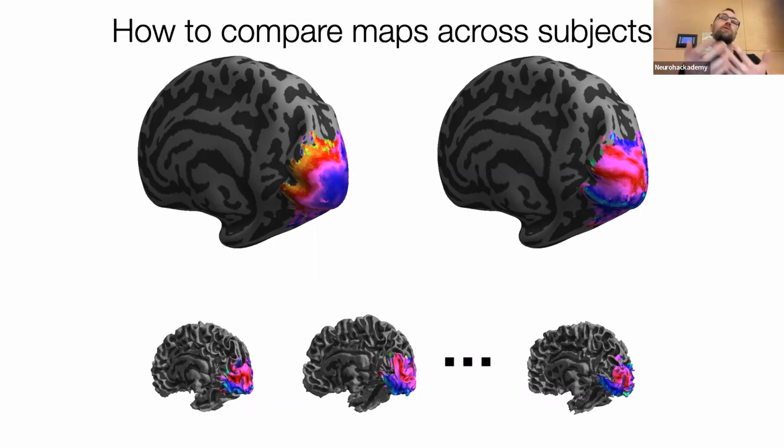And while you really should check your FreeSurfer segmentations yourself, for the most part, they come out really good. You rarely have to correct them, and you almost never have to correct them so much that you need to rerun everything. So FreeSurfer's come a long way in the last 20 years. It was written all the way back in the 90s, which I think is crazy. And it's a very powerful and useful tool.